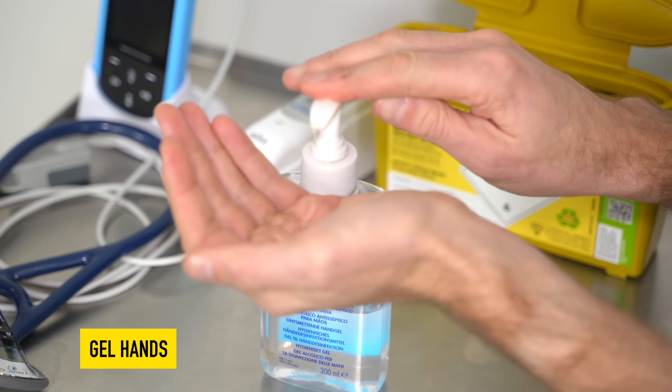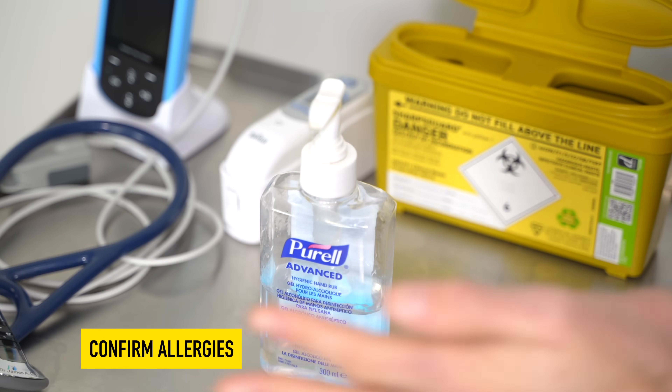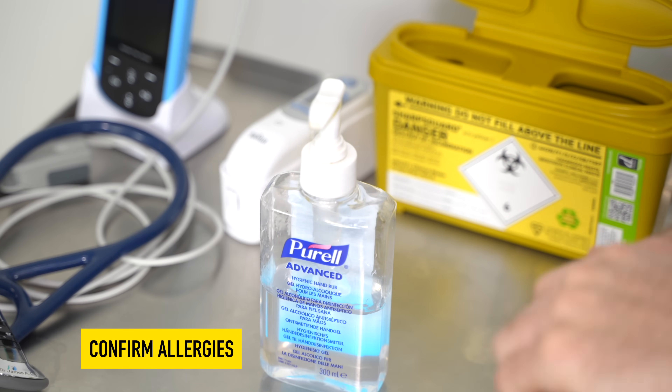So, to start off, I'm just going to gel my hands, and most importantly, before we carry on, do you have any allergies? No. We're using a Vitamin B12 injection, that's correct? Yep.